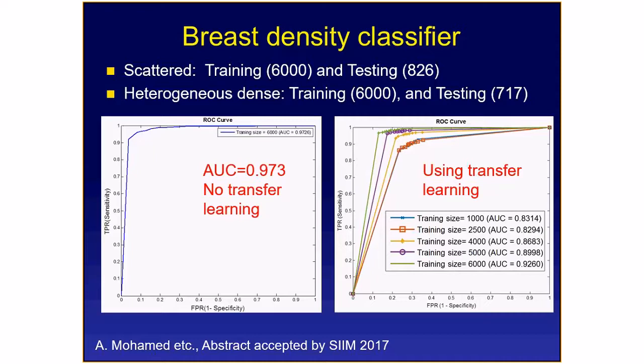Those data are coming from one radiologist? No, they're a mix of radiologists, not only one. We actually did some pre-processing. There's a lot of data here that I didn't present. We also found some cases that are less likely to be right. For example, if we do the quantification of the breast density, and we find the scatter is much higher than heterogeneous, then it makes less sense in a clinical setting. So we excluded those cases, but whether you do the exclusion or not, the finding is very similar. Some change, but still at a similar level.